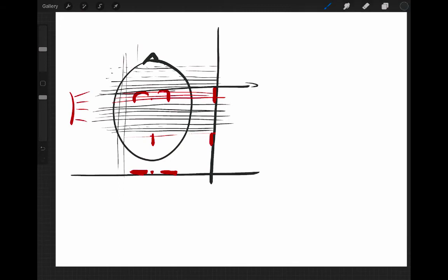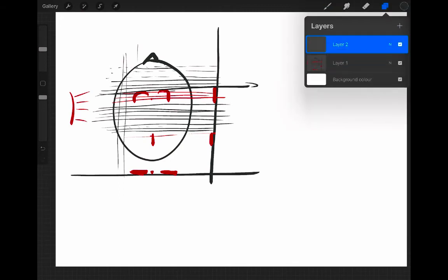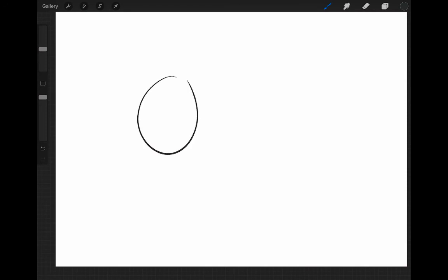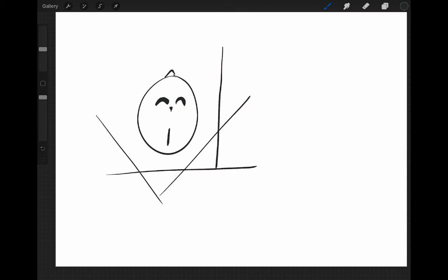Okay, so let me just make a new image here so we have a clean one. If you imagine having this particular guy here again, with the bright things in the middle somewhere, it doesn't really matter what the details are. They would start doing a projection at this angle, at this angle, at another angle, another angle, another angle, right?